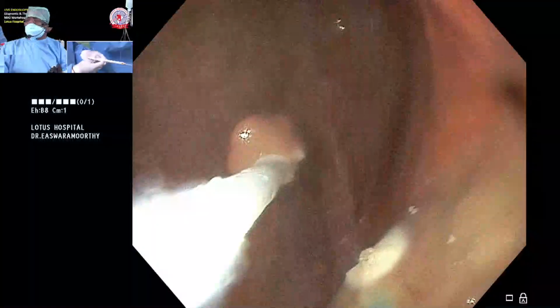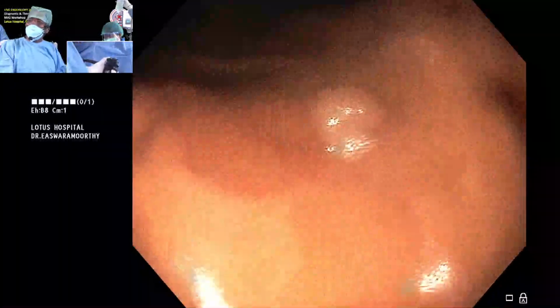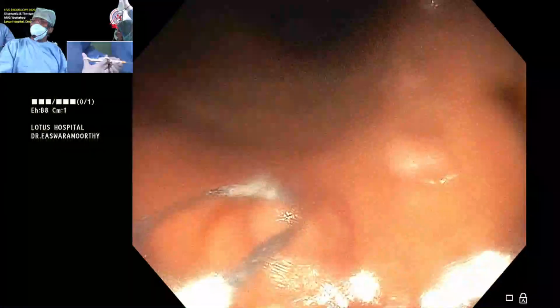Now you can see it has now come completely, and you see the base. Bring the equipment back inside the sheath, do a J maneuver, okay. Then ask your staff to control, exit, you know the trajectory, open, open, come.